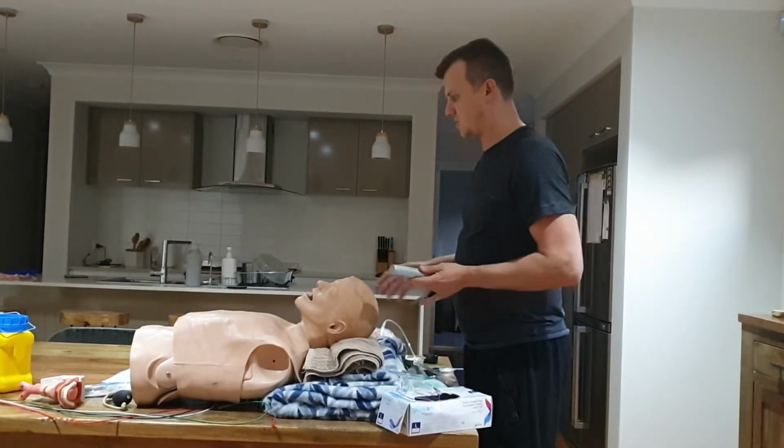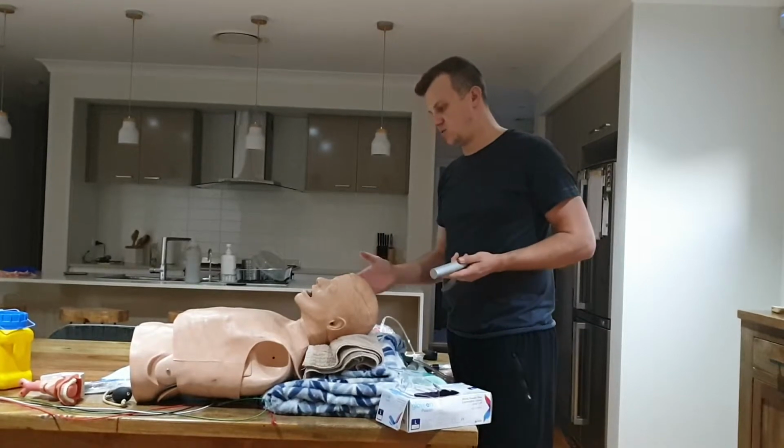Now it comes to the skill side of things. So given all our medications, we've pre-oxygenated the patient, we've got them in a good position at the moment.